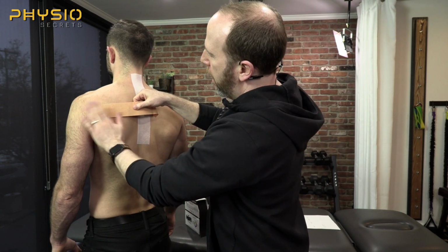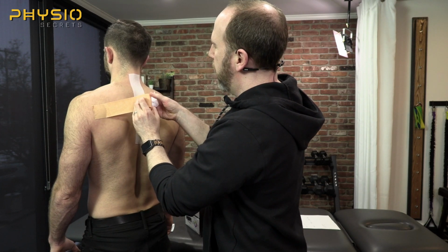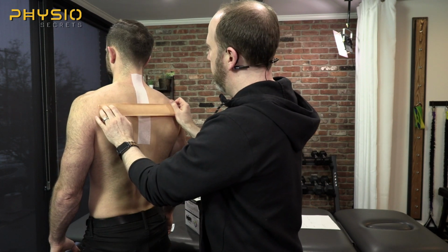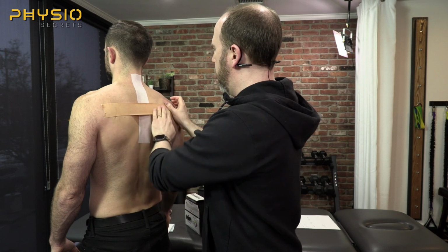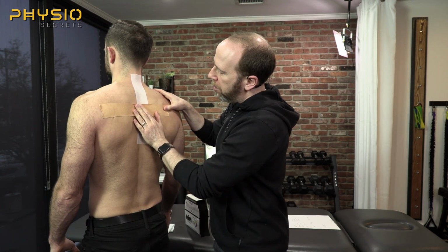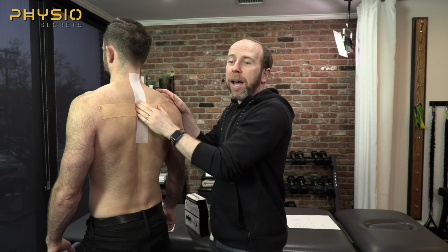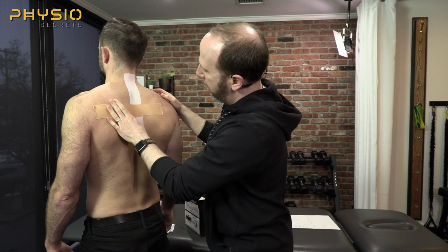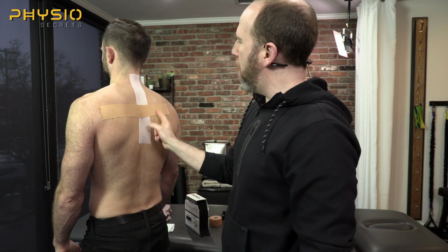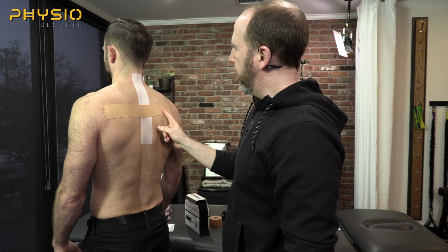I'm going to go over here to the end, get my anchor on, peel off this midsection, come across the other side, and lay that down. And then when I push this midsection in, go ahead and retract your scapula a little bit. Yep. When I push this midsection in, that's actually what's going to give him that feedback of retracting once he protracts. So go ahead and let your scapula come forward. Can you feel the tape pulling you back? Yeah. Okay. Now you feel it all the time, correct? In this position. Yes.